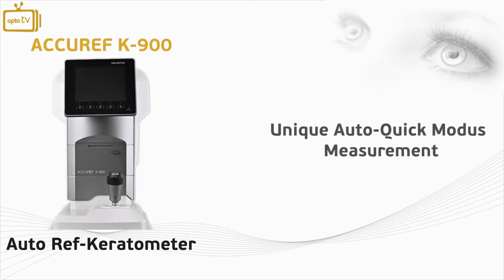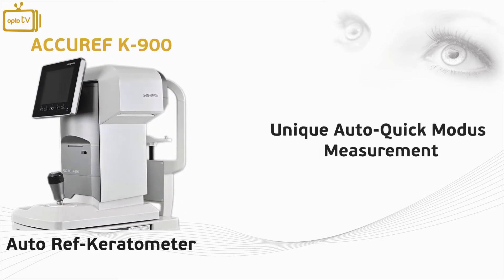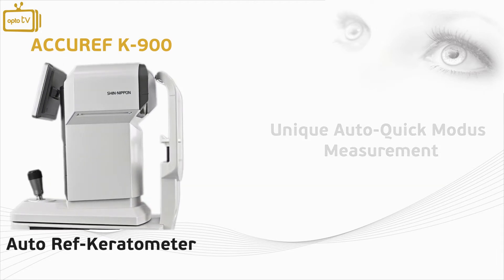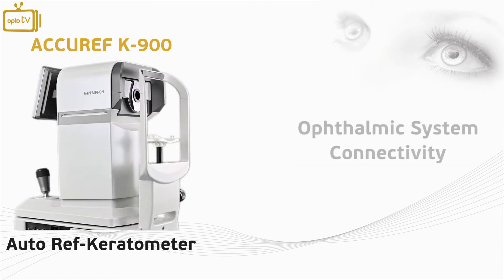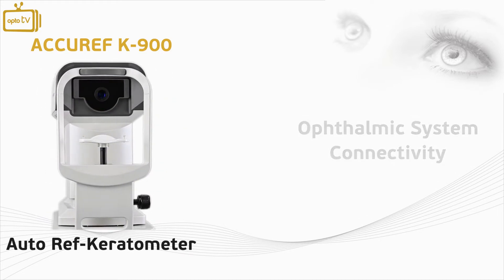The K900 offers an innovative and unique auto quick modus that allows the user to take a quick and accurate measurement. This function is ideal when measuring children and non-compliant patients.